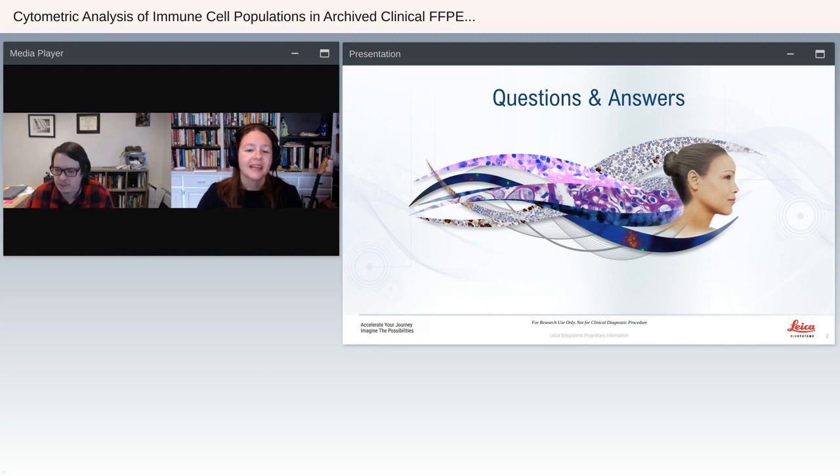Can confocal images be used? Yeah, actually, we frequently use this technique both with our Versa slide scanner as well as our confocal microscope that we have on hand. It works quite well with confocal in the same manner as it does with the slide scanner. You can use a sample to get multiple rounds of labeling and do the same kind of analysis. You can even get a little bit better results with the confocal since you get higher resolution and a crisper image, and so it usually facilitates the image analysis process. Of course, the trade-off is it's slower than the slide scanner.